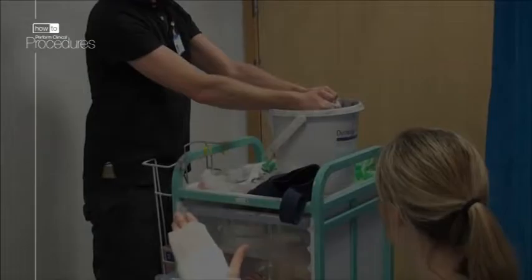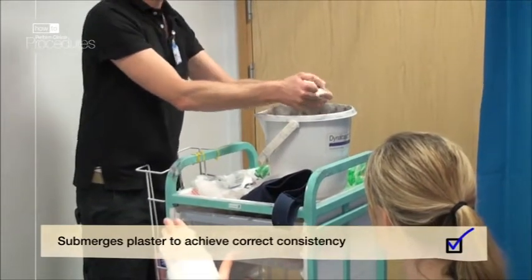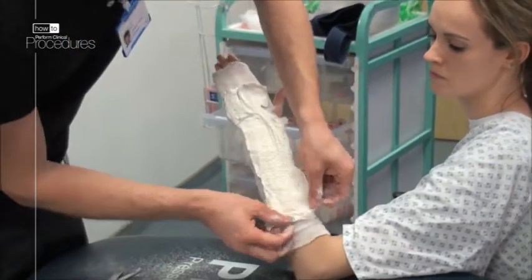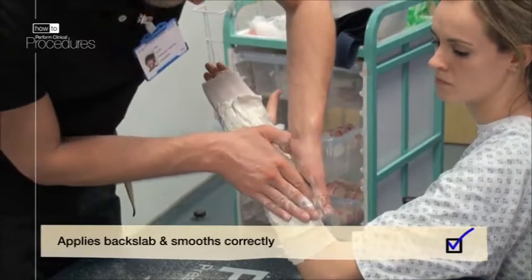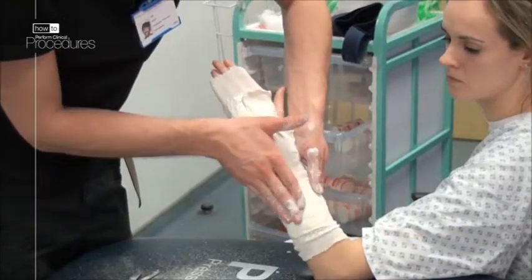Submerge your plaster in the room temperature water for four to six seconds and squeeze off the excess water over the bucket. Lay the back slab over the patient's arm as previously planned, then begin to smooth out the plaster from the middle to the edges, removing any air bubbles.